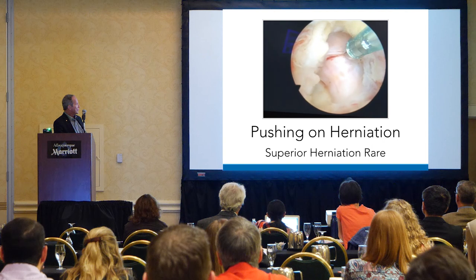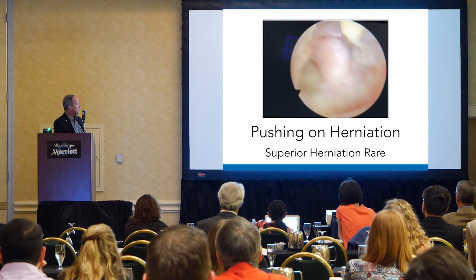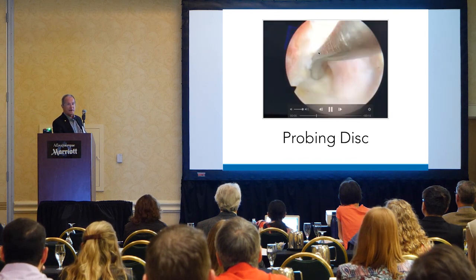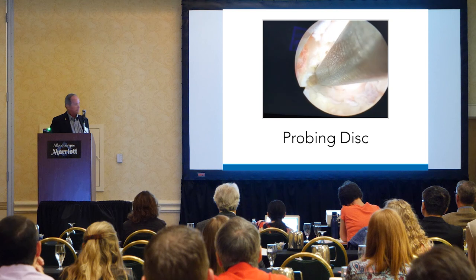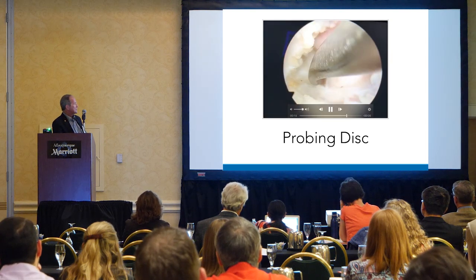Okay, looking good. There it is. We're going to probe the disc herniation, which is pretty good sized, and kind of look and see that we're really over the edge. We're getting to be fairly far lateral and maybe a little bit anterior on the side of the cervical vertebrae. Here's actually where we are right now. You can get a sense of it.